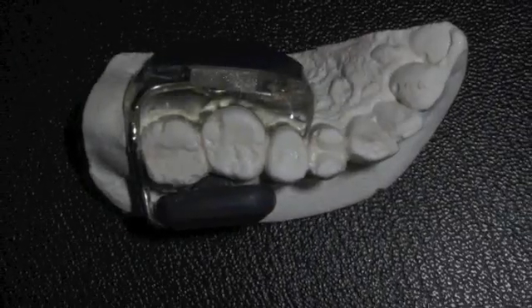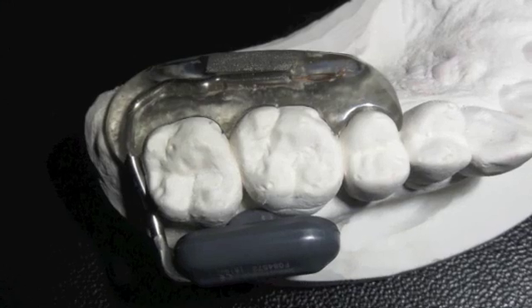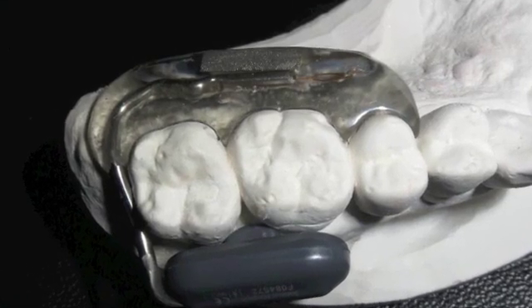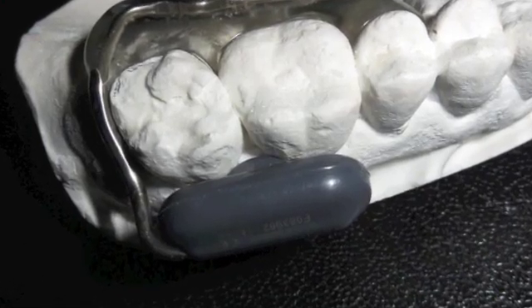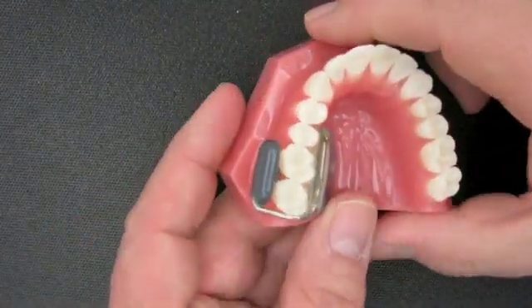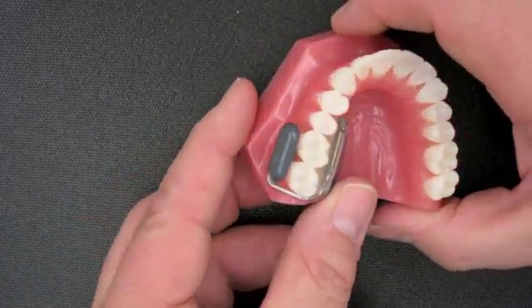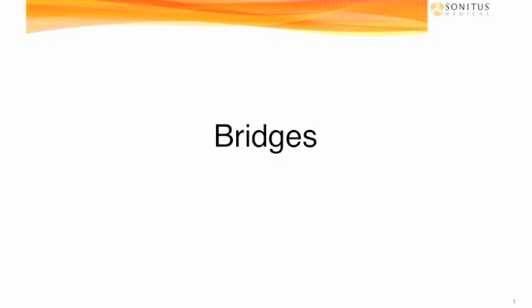Now let's look on the models. Here we see a couple of ITMs that fit very nicely on some dental models that they're made from. Again, that actuator nub needs to fit on two teeth, otherwise the sound quality might be compromised. Here you see the ITM on a model. This is sort of our standard display model.